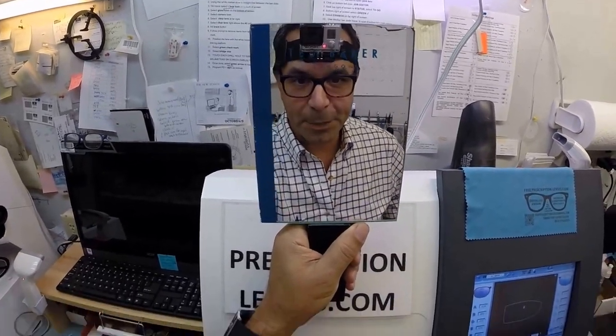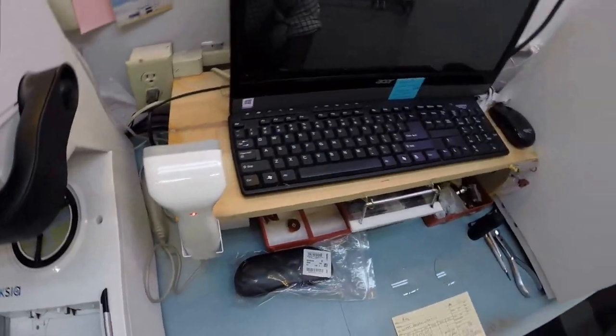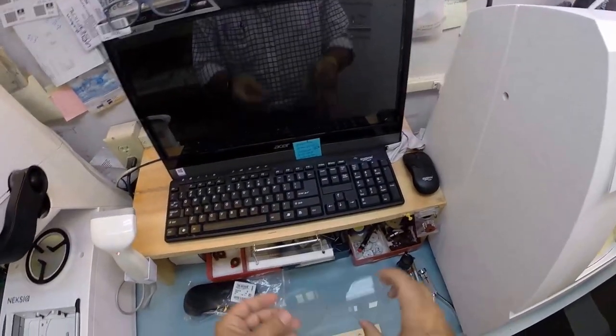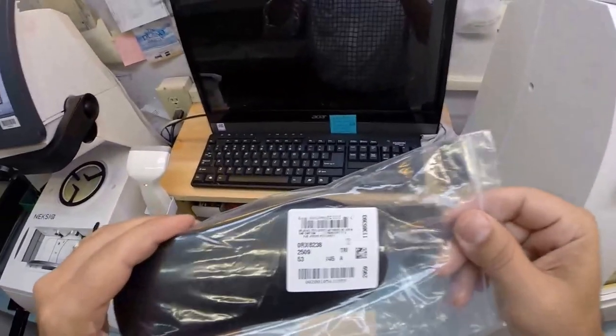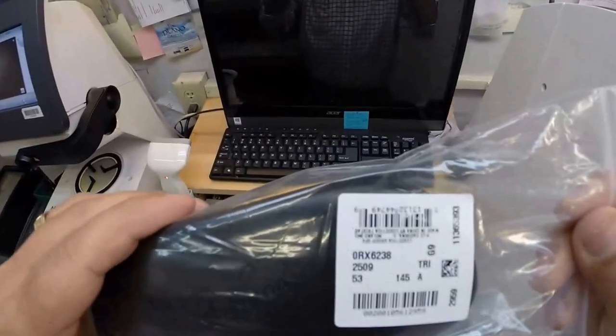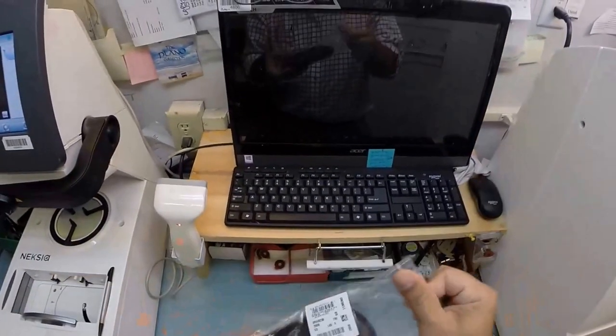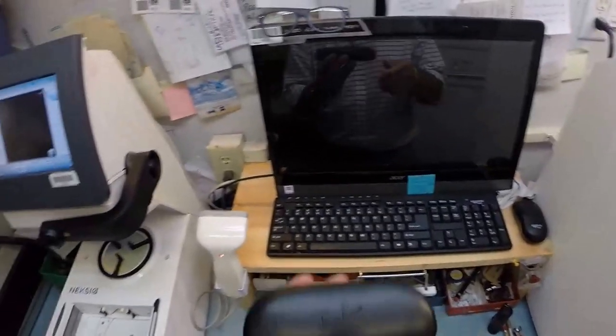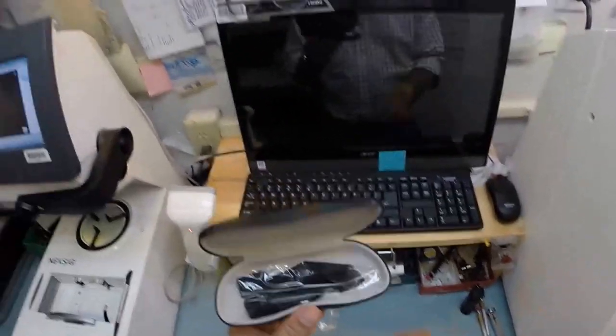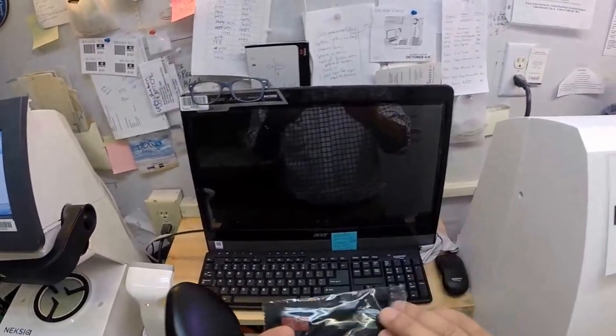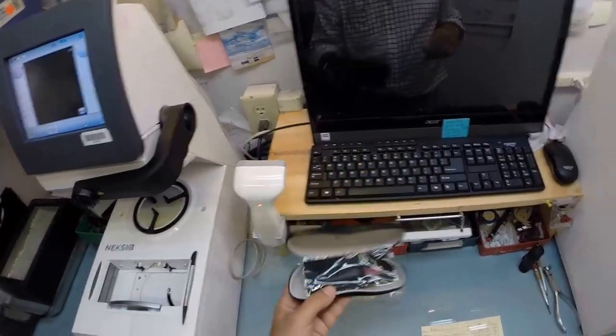Hello Roy in West Haven, Utah. Matthew here with FreePrescriptionLenses.com. Tonight I'm going to be showing you how I cut progressive invisible bifocal lenses for your Ray-Ban 6238 color 2509, which is the shiny black in the 53 eye size. Now let's get on to the show.